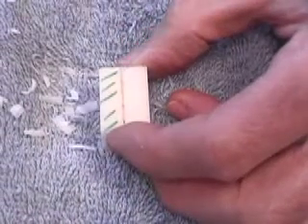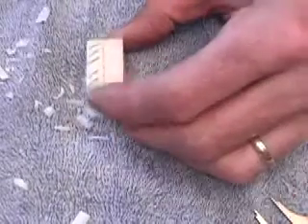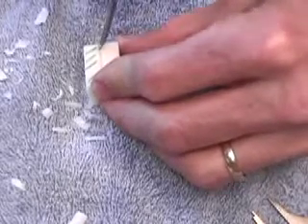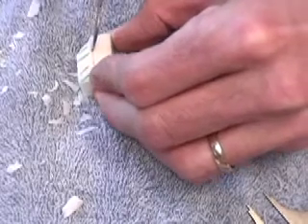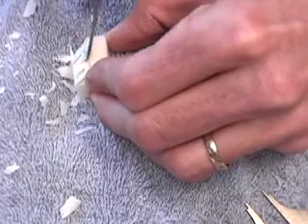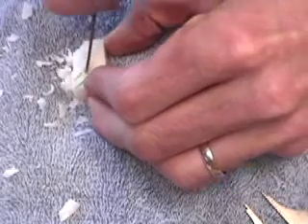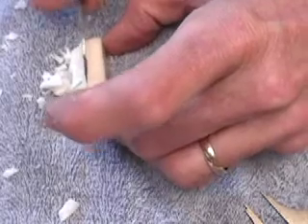Now we're going to take away this portion of the block. Again, tip of the blade, rocking motion, point it slightly away from the center.